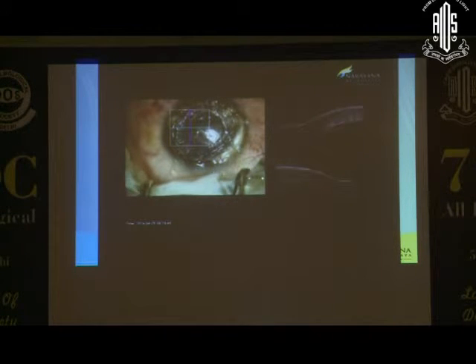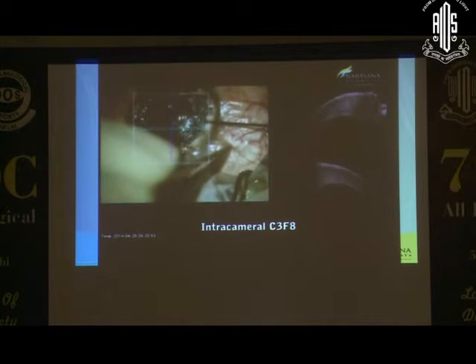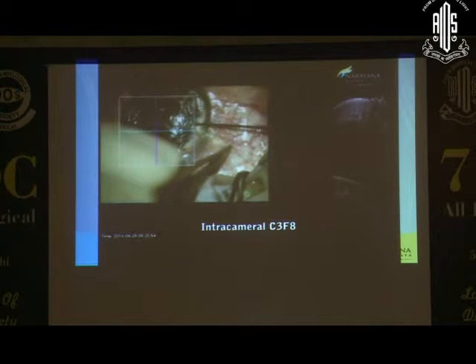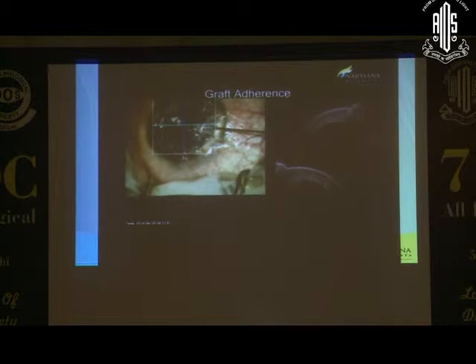We take the help of intracameral C3F8. Now look at that. Once we've injected it, the adherence is quite good. Look at the graft adherence after the injection of the C3F8. We make sure to remove it the very next day.